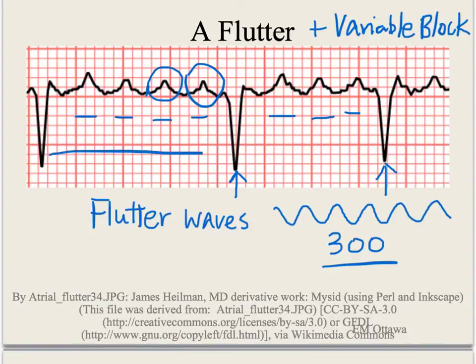Therefore, if you look at the RR interval, you clearly see the RR interval is different. Is the QRS narrow or wide? QRS is narrow.